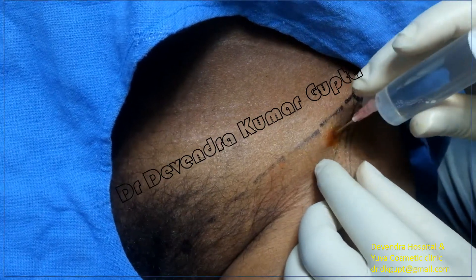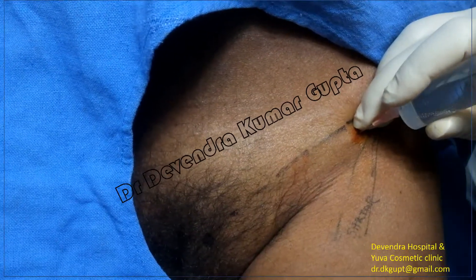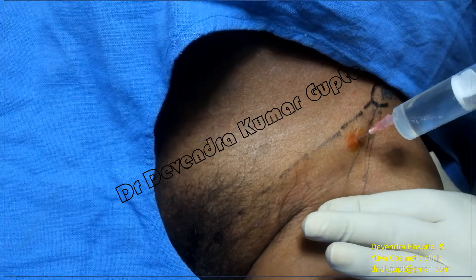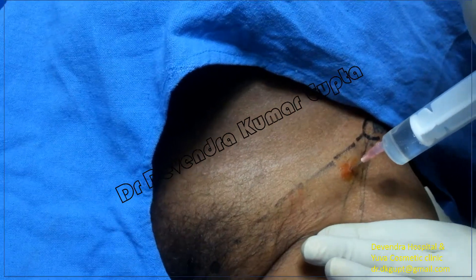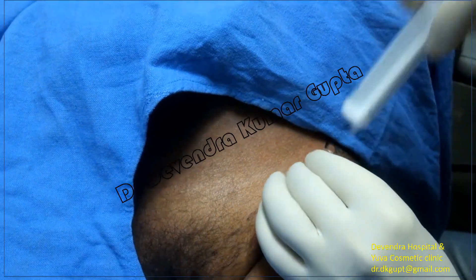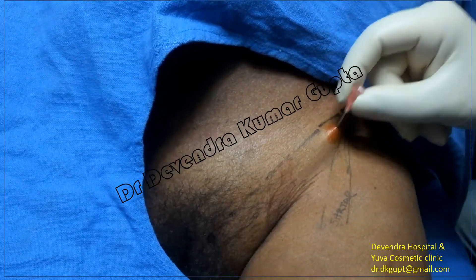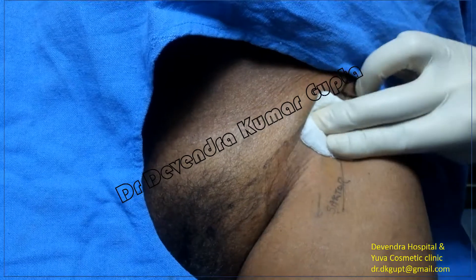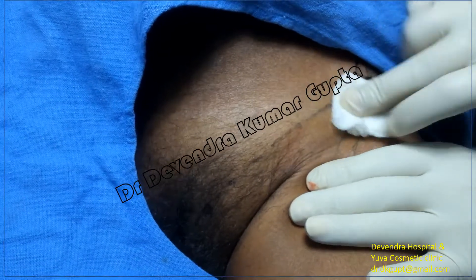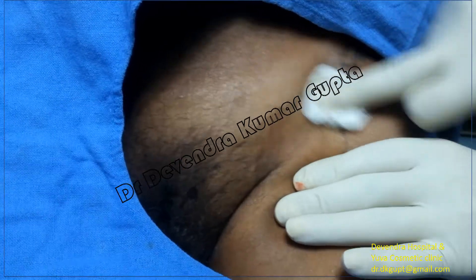The next fascia is the fascia iliaca — again a pop — yes, it is gone. Now aspirate and inject, applying distal pressure to inject the remaining volume. Remove the syringe and check for regurgitation, which confirms the needle is in the fascial compartment. Massage the area and apply distal pressure; the fascia iliaca compartment block is complete. Apply distal pressure and massage the area for four to five minutes.